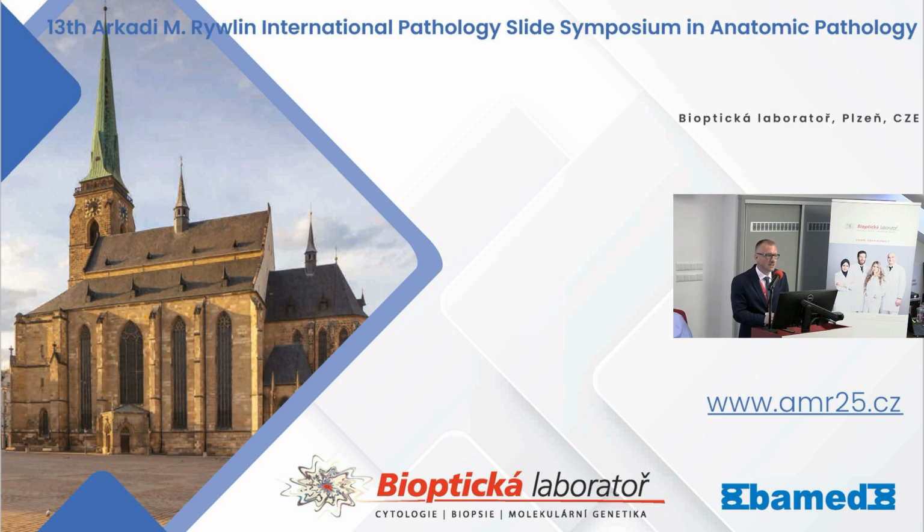They won't be trained for these things for a long time, and it depends on the type of training of AI. It depends on the number of slides and the type of training. If pathologists are signing those foci and showing, yes, this is carcinoma, yes, this is grade 3, and so on.